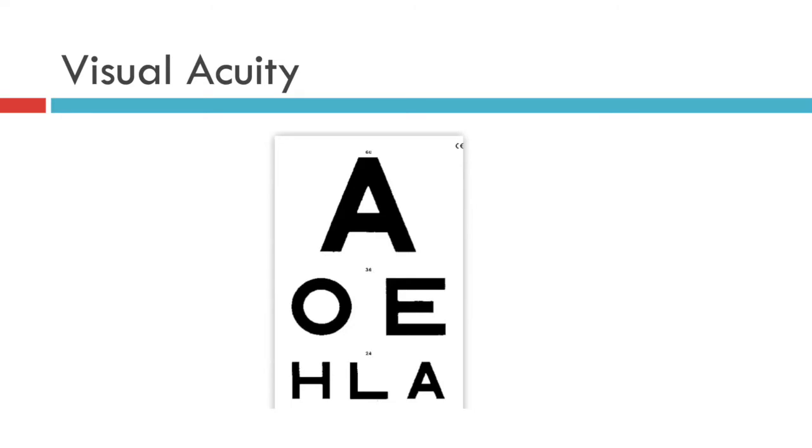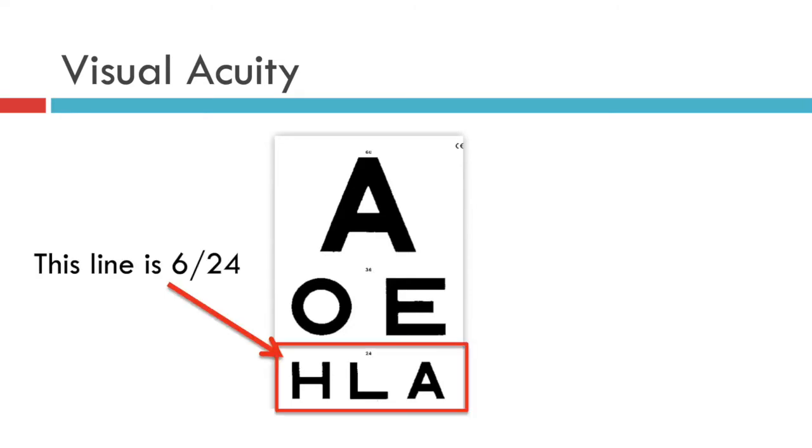The left eye is then tested in a similar manner. Say for instance this patient can read the third line on the chart. On this particular chart that line carries the number 24, so the patient's visual acuity is 6 over 24.